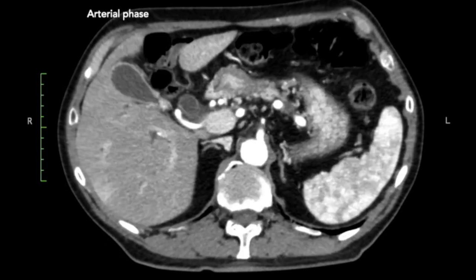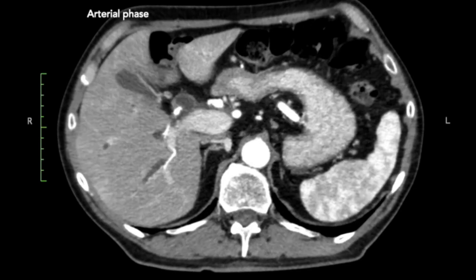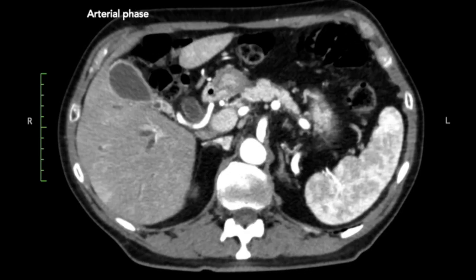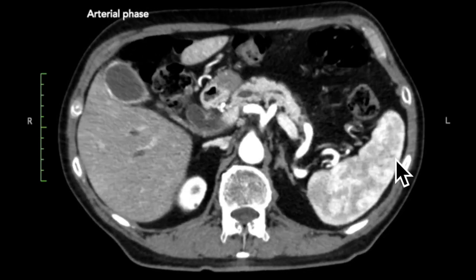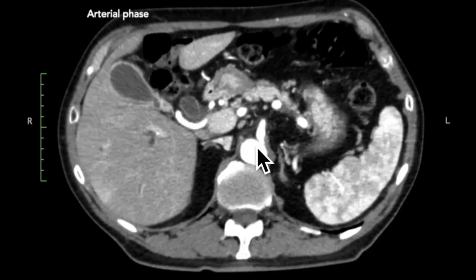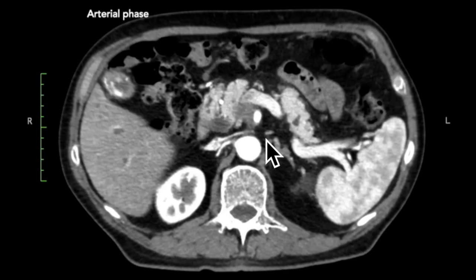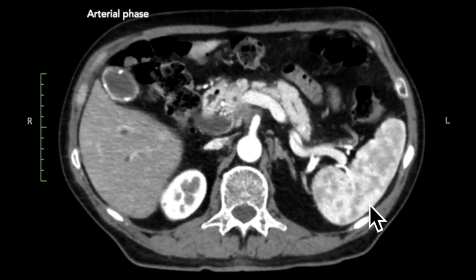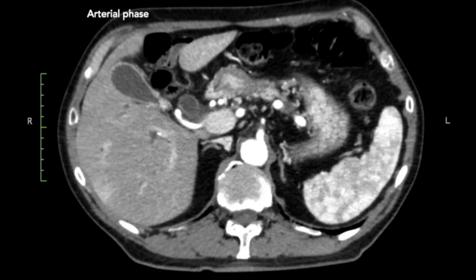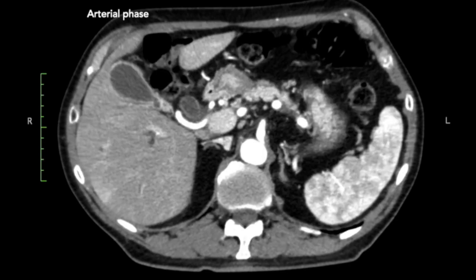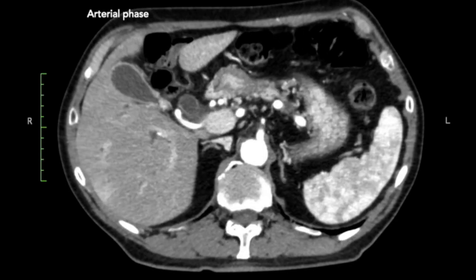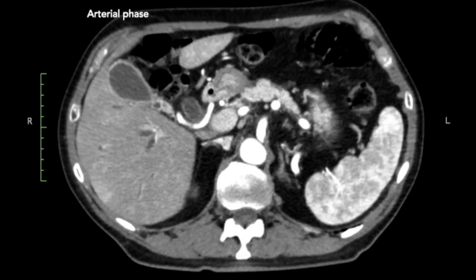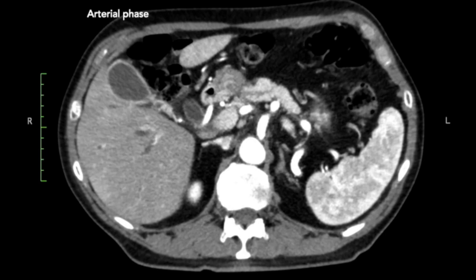First, looking at arterial anatomy. In this case, normal anatomy of the celiac trunk, normal anatomy of the SMA, no relevant anatomical variants, some degree of stenosis of the celiac trunk, and no collaterals seen.